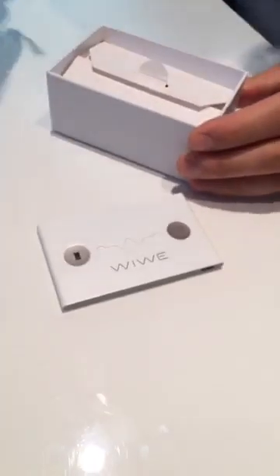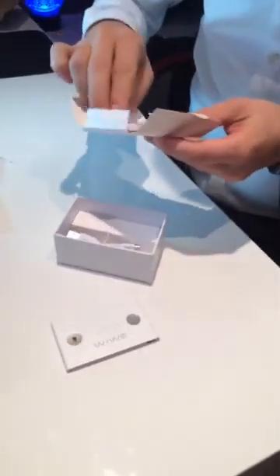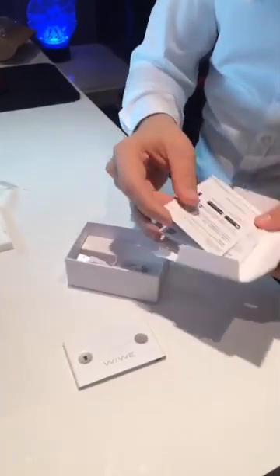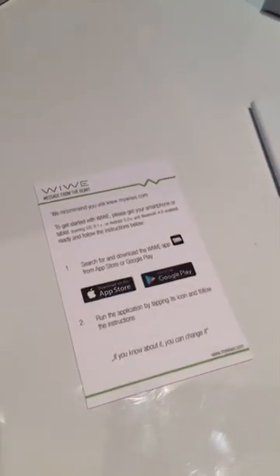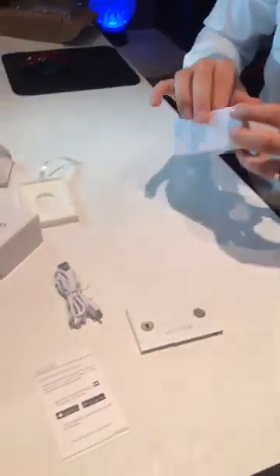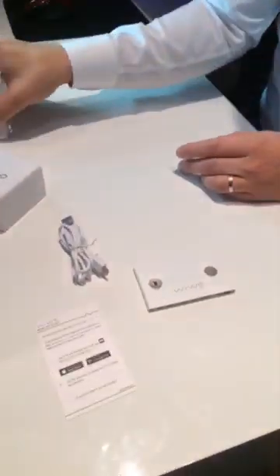Let me also dive into the box. I assume that we might have a few instructions about how to use the WIWE and where to find the smartphone app. They have an application on Android and on iOS as well — quite obvious these days — and there is a micro USB charger. Hopefully today it's charged enough to use the WIWE live.